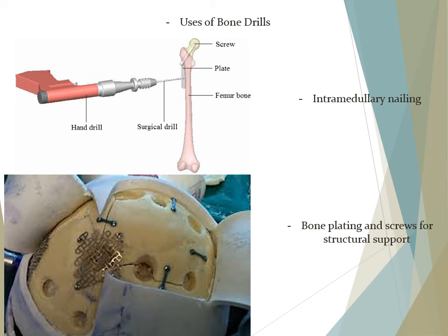So this is a very common operation right now, this use of bone drills, because there are a lot of cases of children or young people on motorcycles having accidents. So guys, if you drive motorcycles, please be careful, because once your leg is broken, not only is it painful, but sometimes it's difficult to put everything together again, especially if the bones are shattered. So we use a lot of plates, a lot of screws, and it's difficult, and the recovery is very long. So please drive safely, drive defensively.